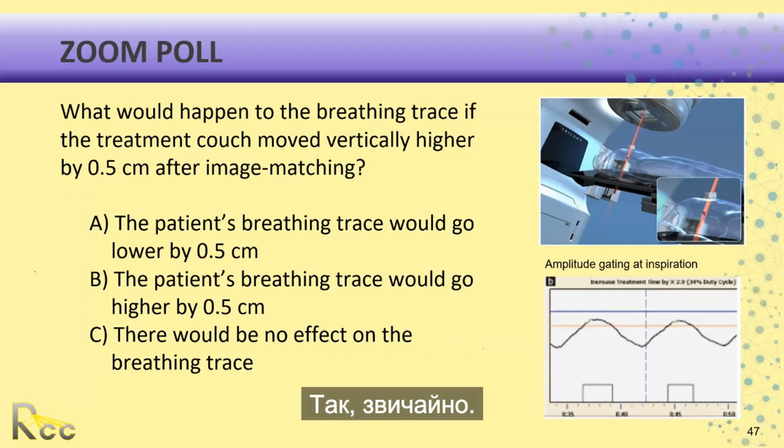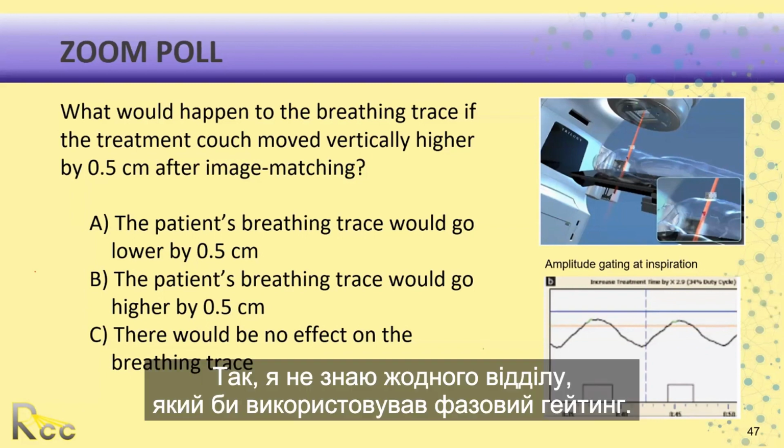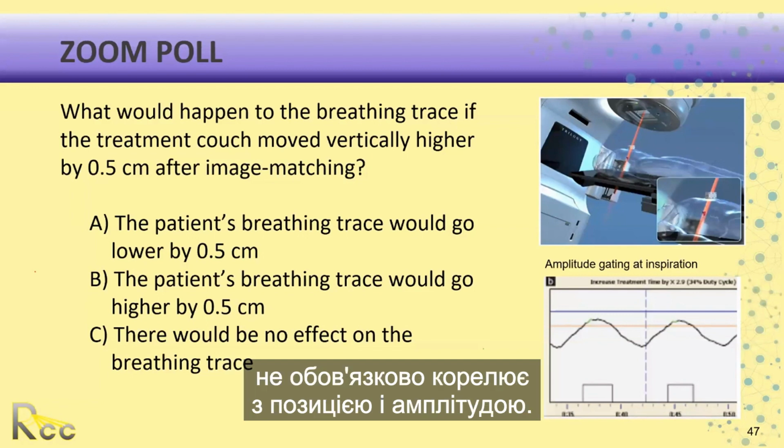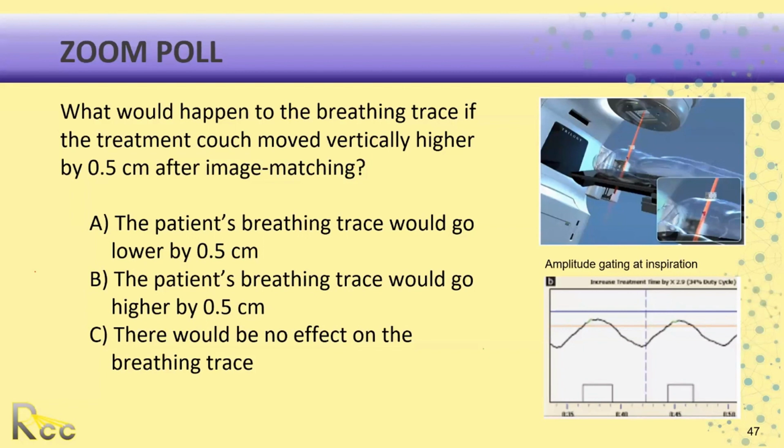Yeah, for sure. I don't think I know any departments that use phase gating. I think it's because we're worried about position, and phase doesn't necessarily correlate with position, so amplitude tends to work better for us.